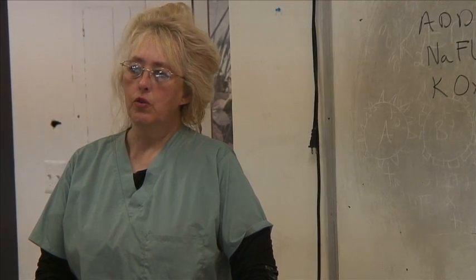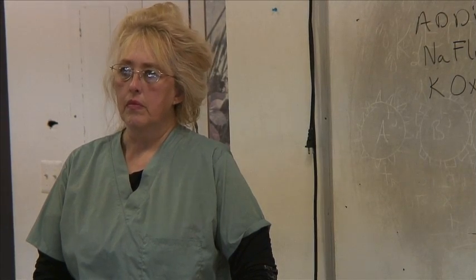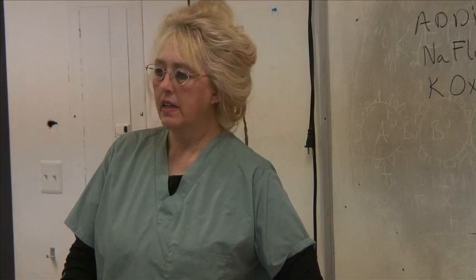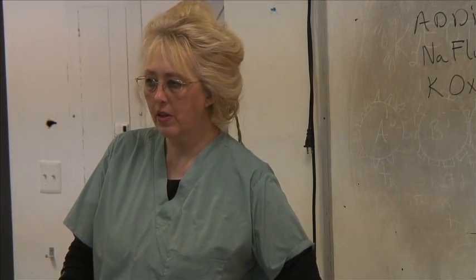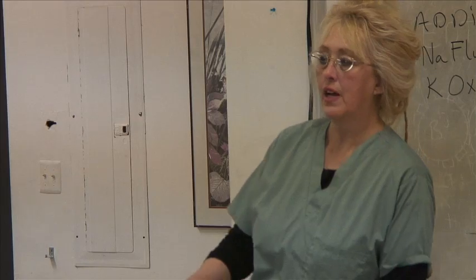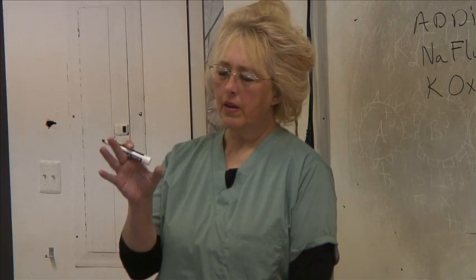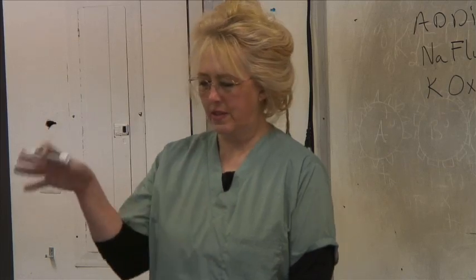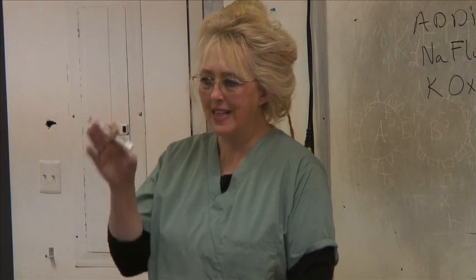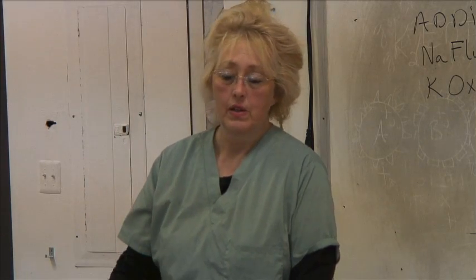You choose the amount of tubes based on the department and the family of tests that are used. So anything that has to do with hematology is lavender. Anything that has to do with blood banking is pink. Anything that has to do with metal toxicology is royal blue. Any serum separator tube test, or any metabolic test that would normally be done in a serum separator tube, is done in green. You only use the green tubes for your metabolics.